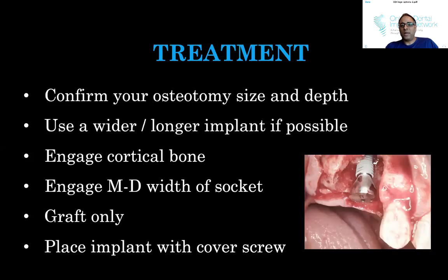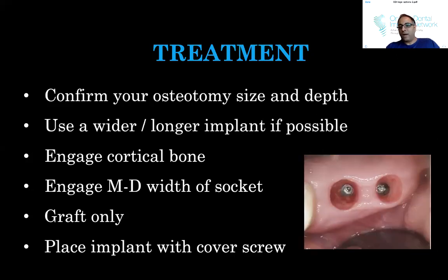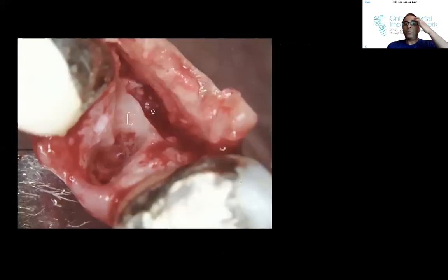And so I placed the implant, engaged that, and then I grafted the whole thing. I'm not going to take you through the whole case, but that's what it looked like afterwards. And we had a nice healing. This was a one step, one surgery. This is 5 months post-op. What about a case like this?